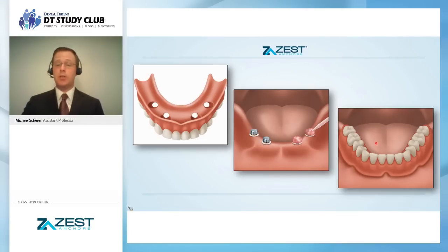One thing that I find works extremely well in my clinical hands is I pick up all 4 of these at a time. Or if I'm picking up a 2 locator overdenture, I pick up 2 at a time. I know by convention we teach that you should pick up 1 and then 1 and then 1 and then 1, and that turns into a really long clinical appointment. And what I found from my own personal clinical experience is that sometimes that one attachment doesn't go down all the way, or maybe when you have 3 of them or 2 of them, maybe over here and here, when you snap that denture into place, sometimes it's not down all the way. Your clinical goal is to ensure that this tissue surface is fully and intimately adapted to the tissue-bearing surface.